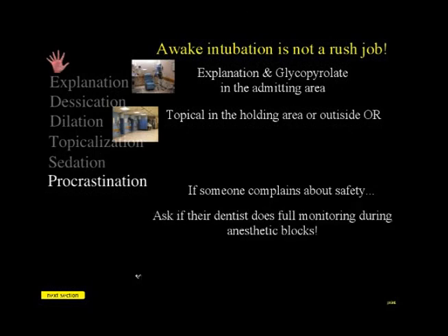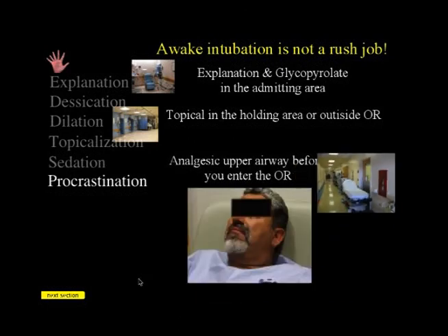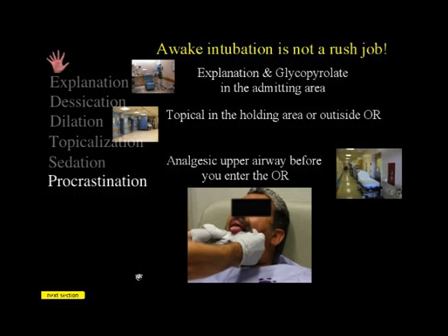If someone complains about safety, ask them if their dentist monitors when he injects local anesthetic and epi into your gums. I think this is perfectly safe to do, and the model is dentistry. Dentistry does this all the time with injection. You're just doing topical anesthesia. I will not bring the patient in the operating room until they will tolerate an oral airway.